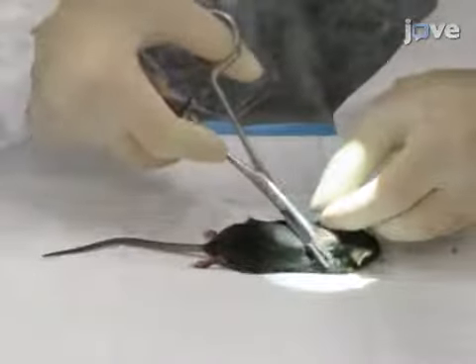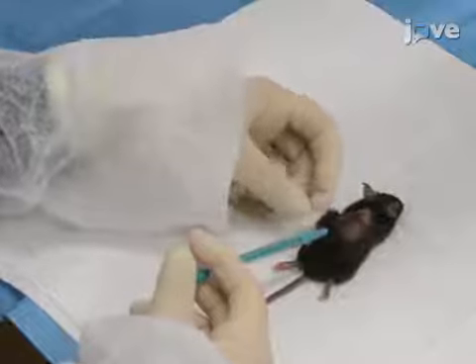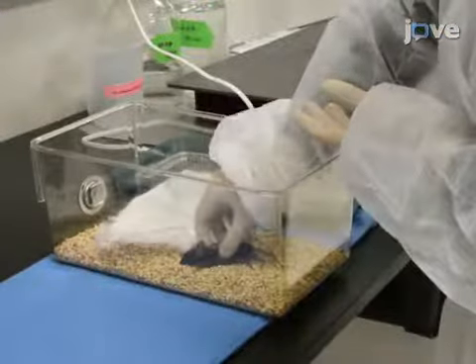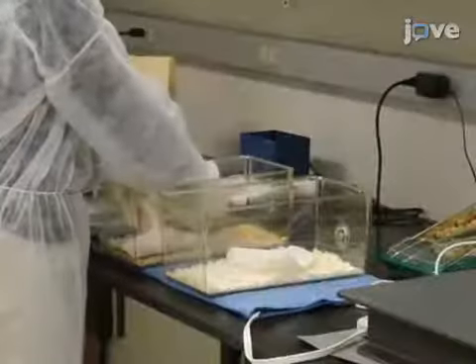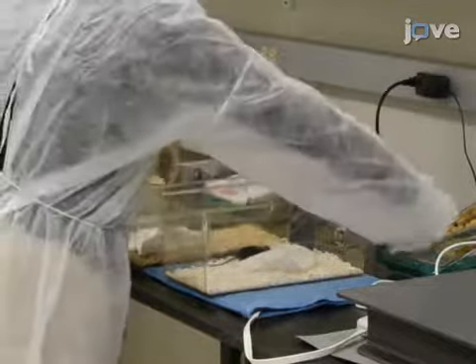After suturing the incision in layers, inject the animal with 1 milliliter of 0.9% saline subcutaneously for hydration and place it onto a temperature-controlled pad until consciousness is regained. Then house the mouse in a clean cage with easily accessible water and food.